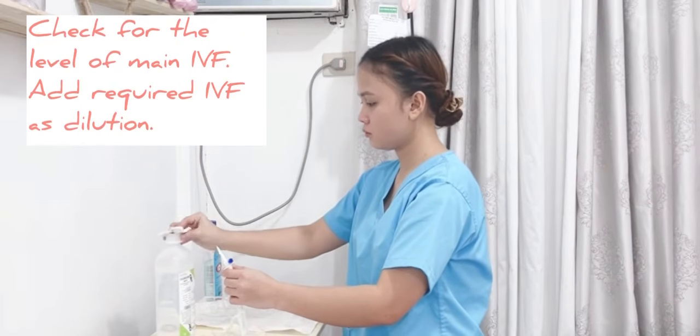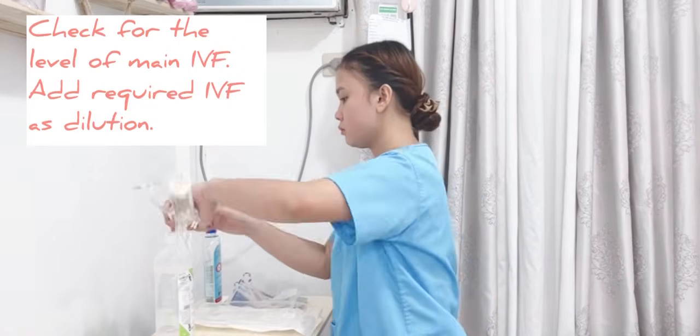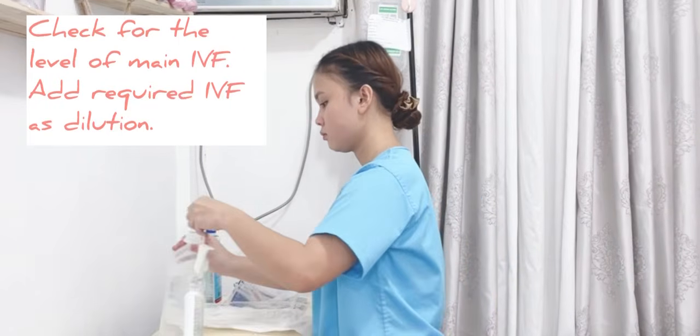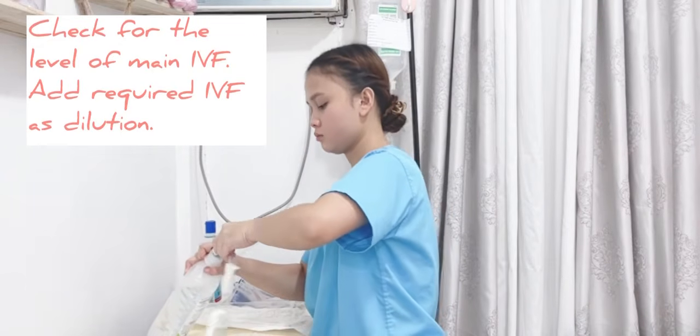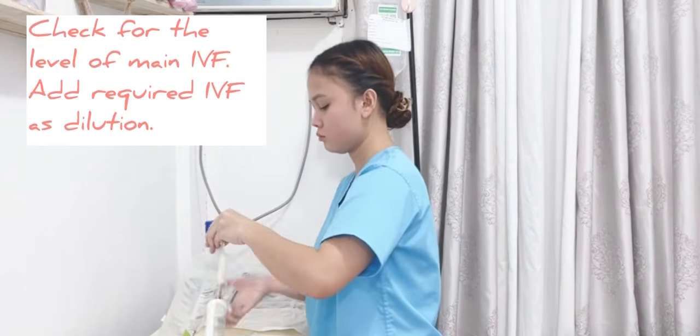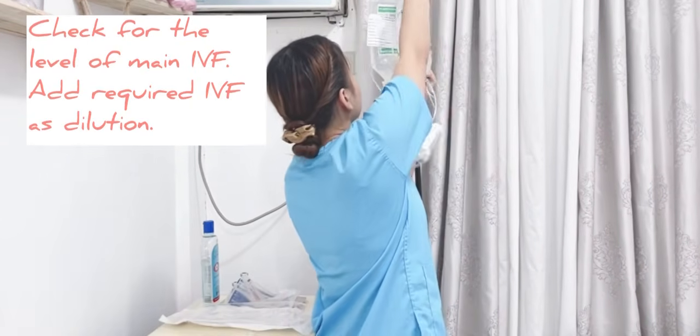Then disinfect the rubber injection port of the Soluset and incorporate IV drugs, as it removes microorganisms that could enter container during needle insertion. Then spike the Soluset in twisting motion, then incorporate the required IVF solution. Then hang it in the IV pole.